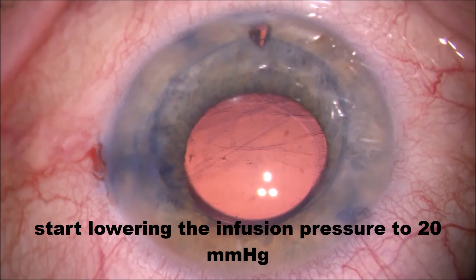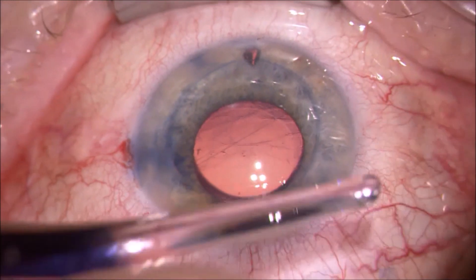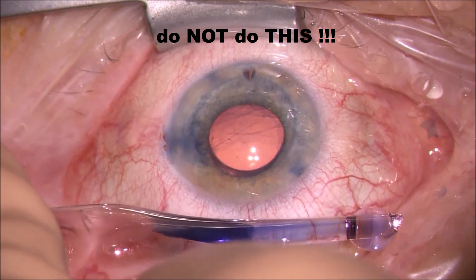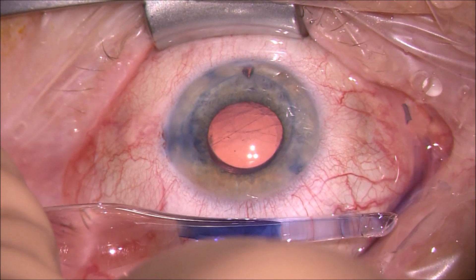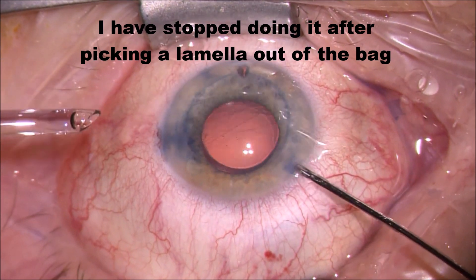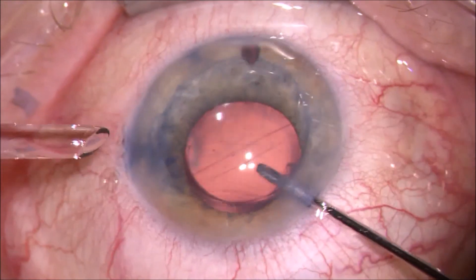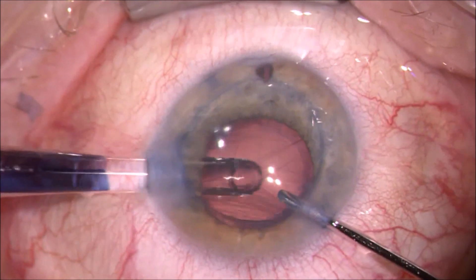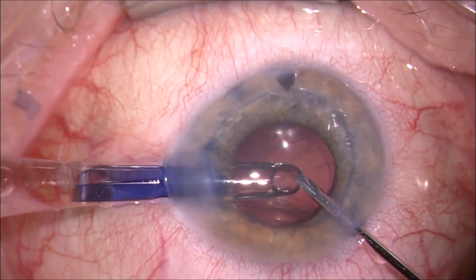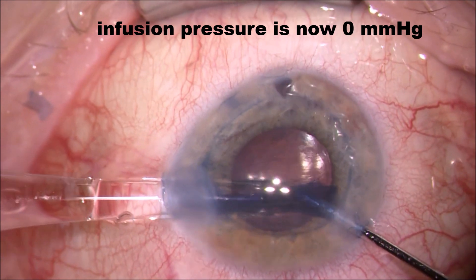What I forgot to point out at the beginning is that we are doing a raw DMEC implantation and will run through the hacks. Watch what I'm doing here — I'm holding the lamella with the injector and pushing forward just a little bit. I used to do this a lot, but one time I injected the lamella on top of the eye rather than inside the anterior chamber and was really struggling to put it back. I have absolutely stopped doing this and would recommend the same to anyone. Even if you are highly skilled with DMEC, it will happen once every 500 or 1,000 cases, and even that is too often.